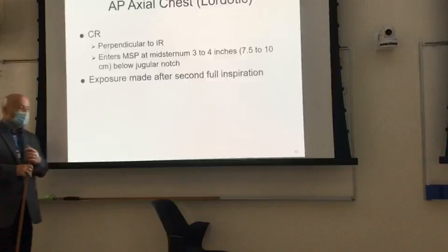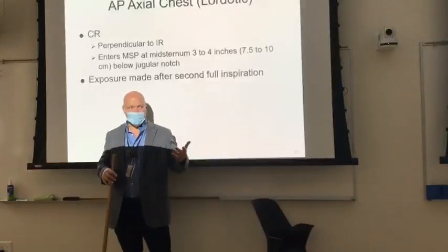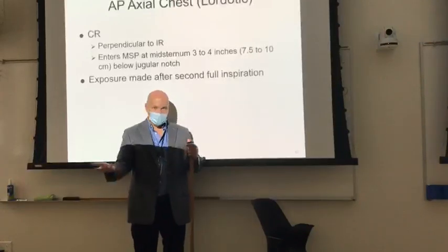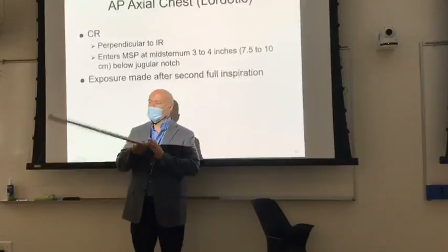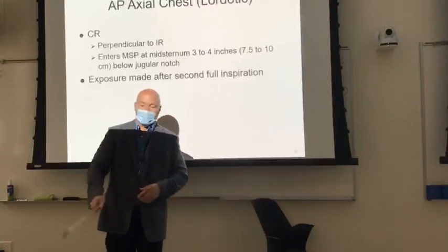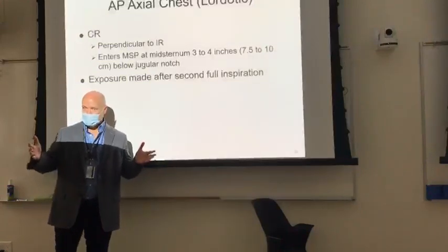So how you're gonna do this without leaning the patient backwards is by truly doing an axial. You have the patient stand up, or if the patient's on the table, they're just laying flat on their back, and instead of angling to the sternum, you're gonna angle cephalad. And the amount of angulation is gonna depend on how thick the patient is.